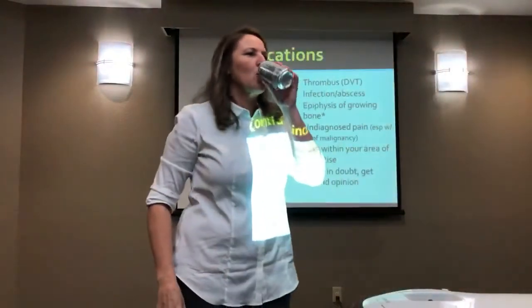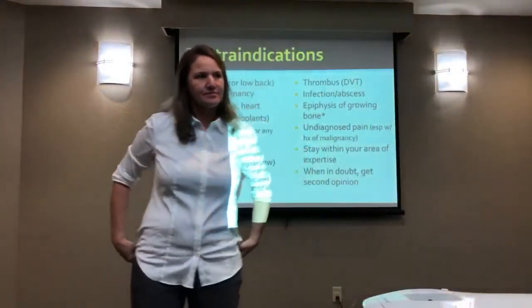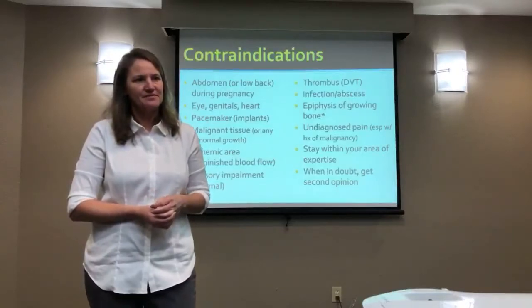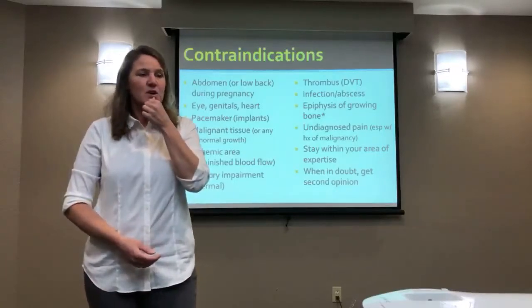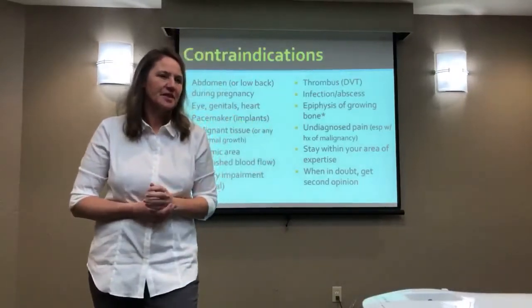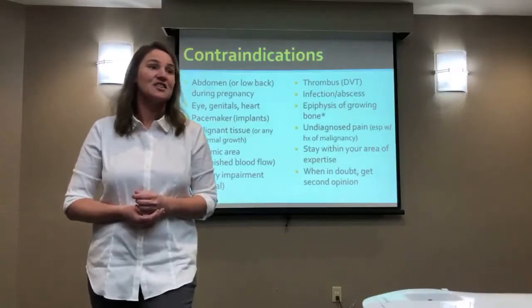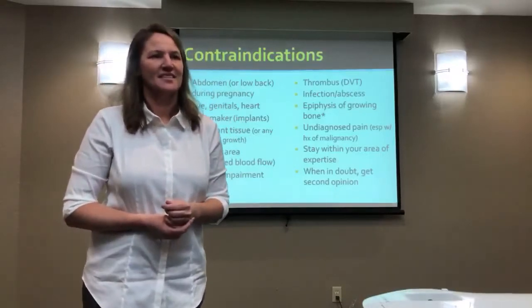Can I ask you a question? Sure. Because this seems to be the basis of a lot of disbelief that this works. Right. And so how was this proven? And what are we doing in terms of proving this again through more studies? Right. Where are you hearing the controversy? Just everywhere, from other therapists. Yeah. But also when we've done meta-analysis and tried to pull in, we don't have it, it's not there. There might be one study, but it's not backed up. So to say this is fact, that macrophages are actually enhanced, we're not finding it.